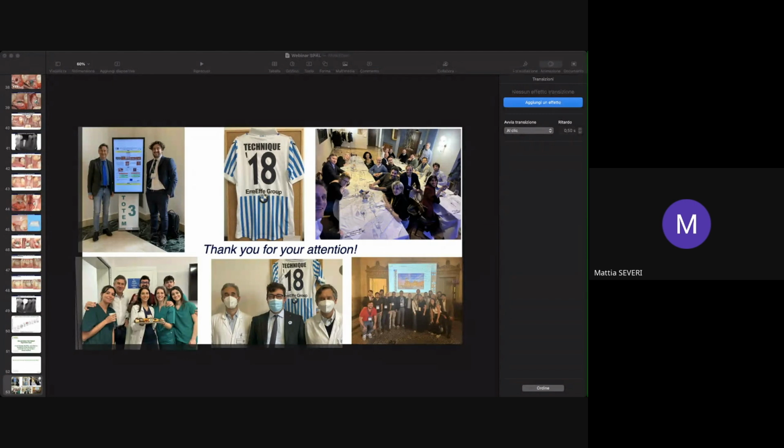How much horizontal defect can be managed in an atrophic posterior mandible? You have anatomical limitations, that is the bone profile of the adjacent teeth. You can augment, but you cannot augment more than the ideal line connecting all the convexities of the tooth or the previously present tooth. But if you place the implant in a correct prosthetic position, you will have enough space to increase the thickness of the peri-implant hard tissue, in order to correct the dehiscence and have an implant in a prosthetically correct position.